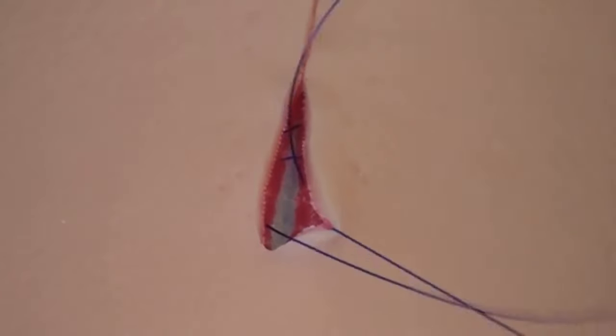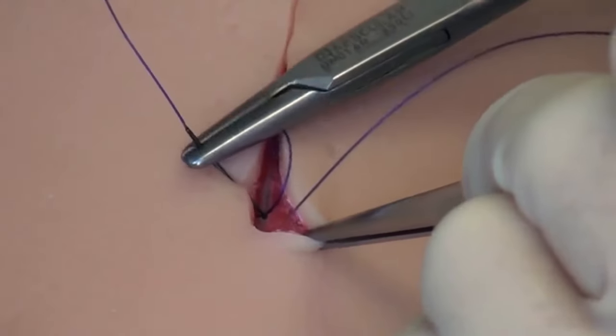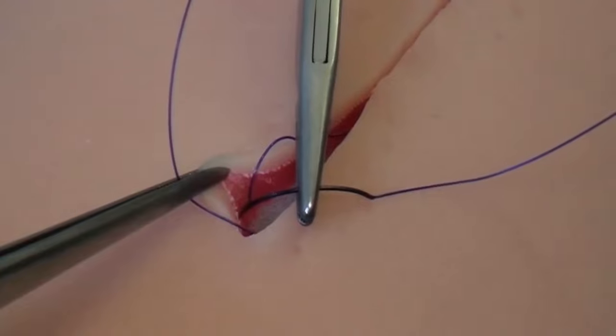In the end, the thread is not pulled through completely. A loop is left to close the suture with a surgical knot. The final stitches at the wound angle are performed deeper in the dermis, allowing the knot to be deeply buried in the tissue.